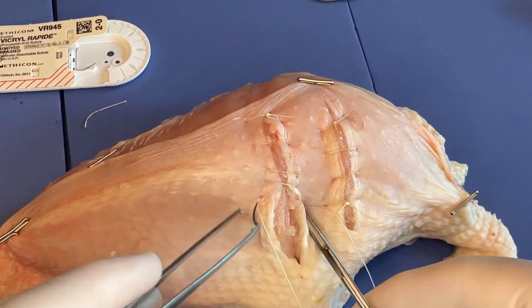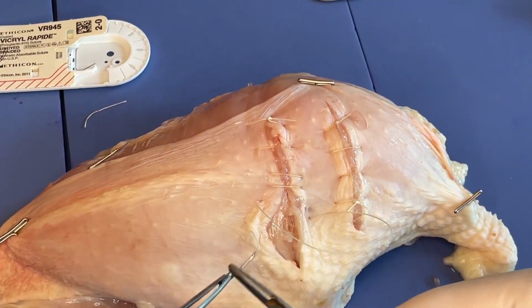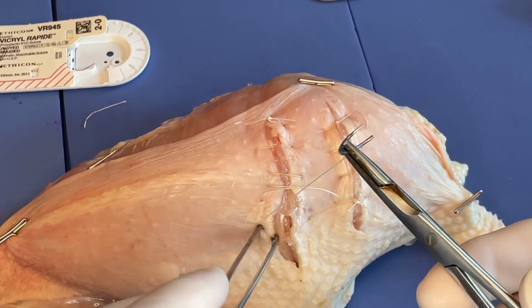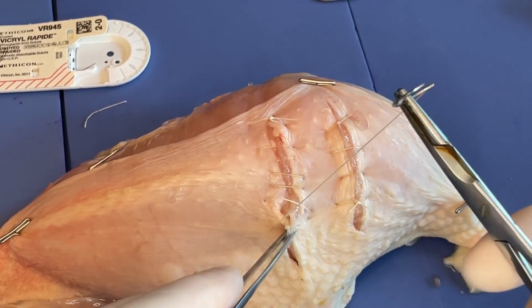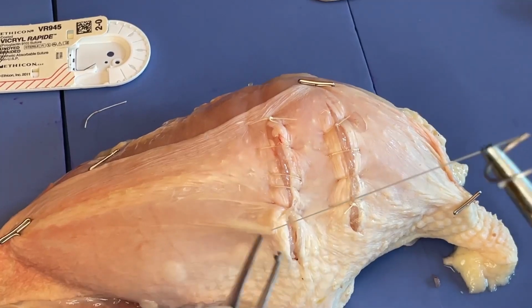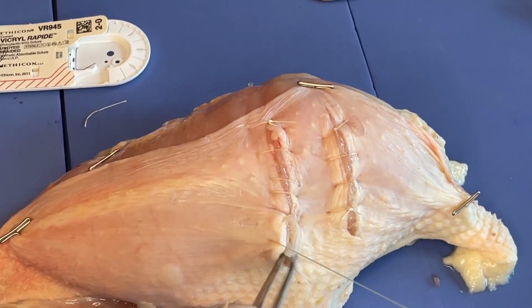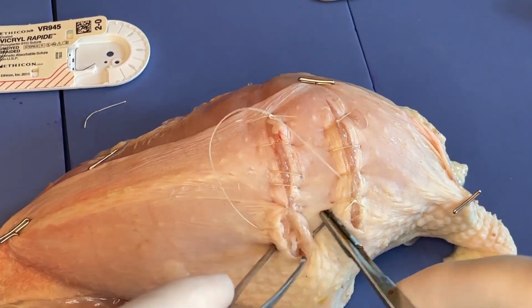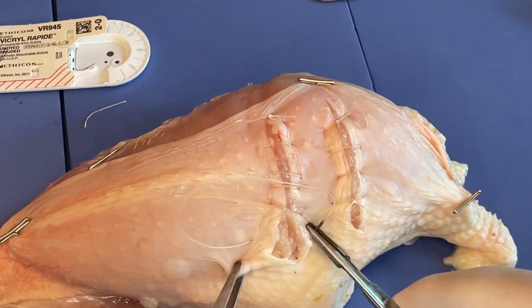drive a little bit more of that needle length through, and then again, as I'm tensioning down the suture, I can grab tissue and place it where I want it and get the closure that I want. So again, we've got a little bit better closure on the skin with those last couple of throws. And we'll do one more here.